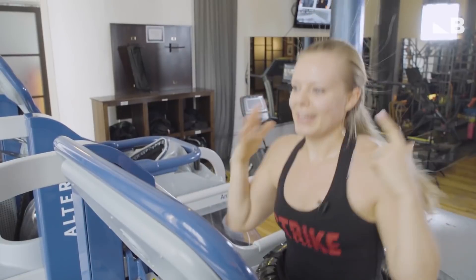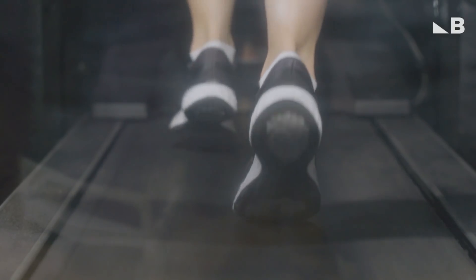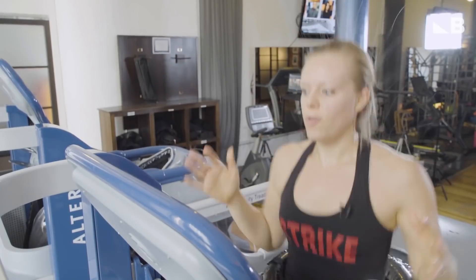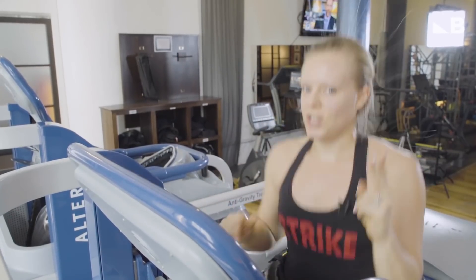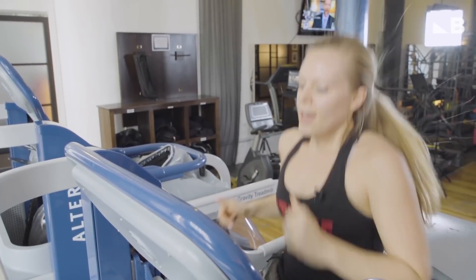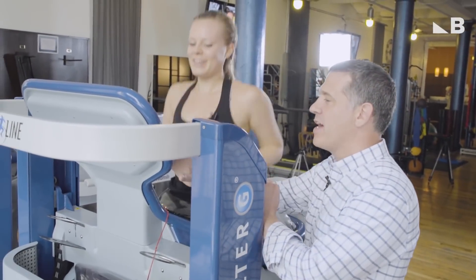It's taking me a lot of concentration to keep that form — I don't know if I'd be able to do it on a normal treadmill or outside. This is helpful so far because since I'm not feeling that pain, I can focus on those two changes you asked me to make. How are we doing? Good. Ready to get out? Yes. Let's go ahead and hit stop.